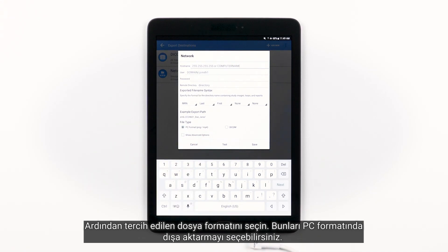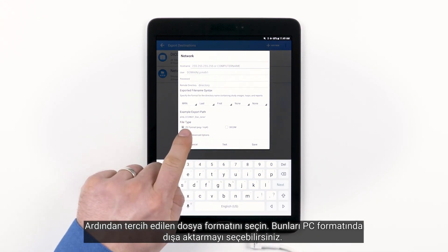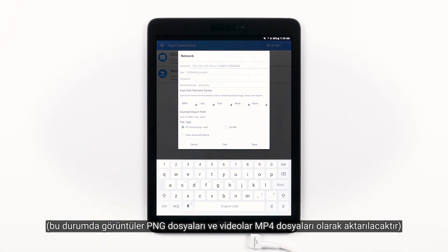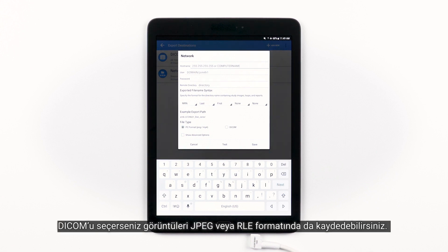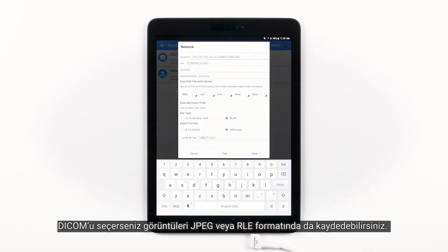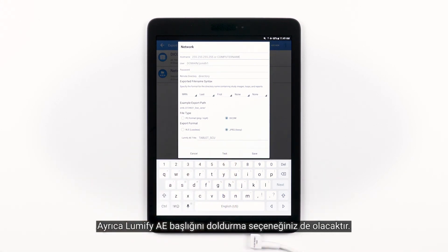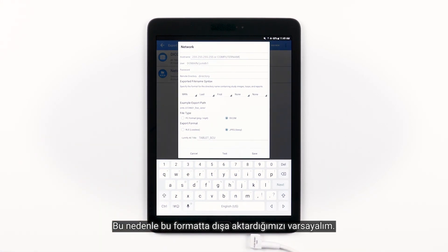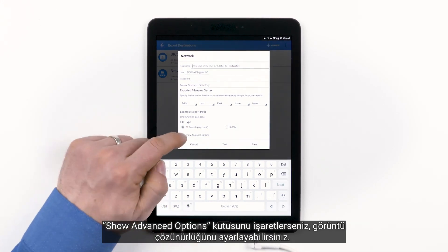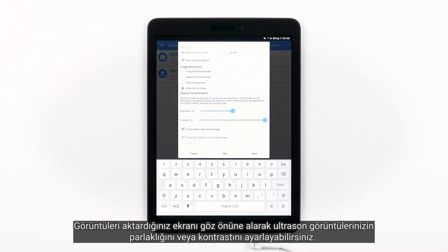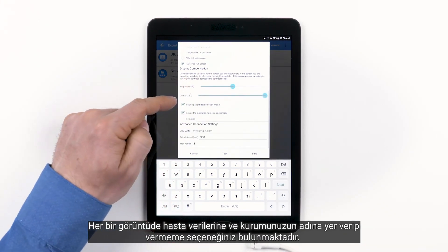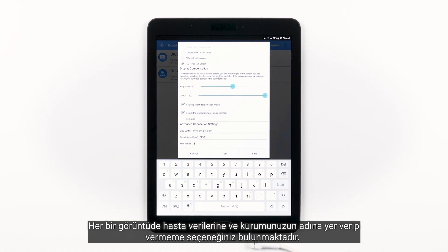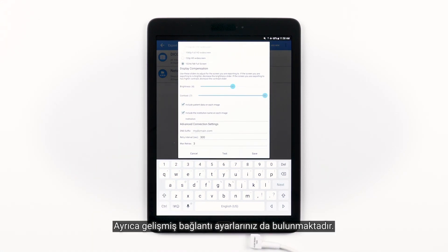Next, choose your preferred file format. You can choose to export in PC format, where images will come out as .png files and videos as .mp4 files. If you choose DICOM, you will then have the option to have the images saved in JPEG or RLE format, and you'll also have the option to fill in the Lumify AE title. If you check the Show Advanced Options box, you can set the image resolution, adjust brightness and contrast, and include or exclude patient data and institution name on each image. You have the same options at the bottom to cancel, test, or save.